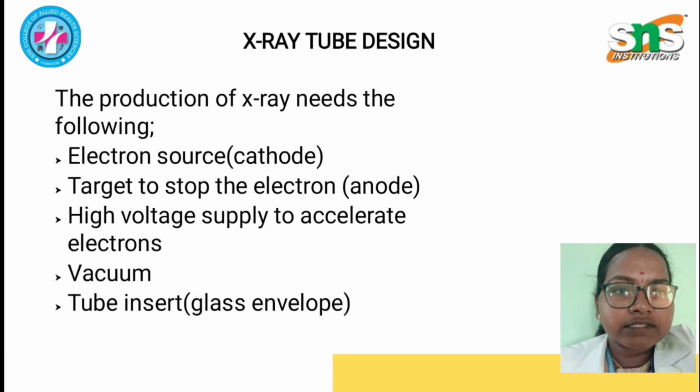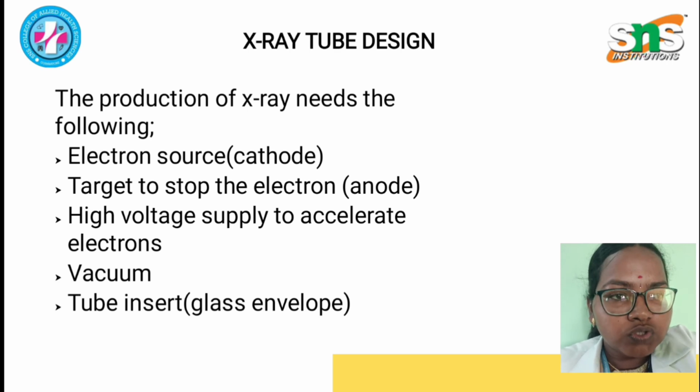Next comes the X-ray tube design. The production of X-rays needs certain components: an electron source, which acts as the cathode; a target to stop the electrons, which is the anode; and a high voltage supply to accelerate the electrons, a vacuum, and a tube insert.